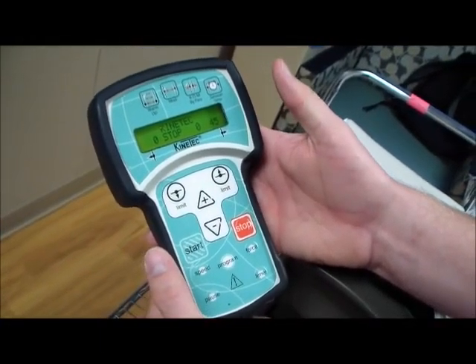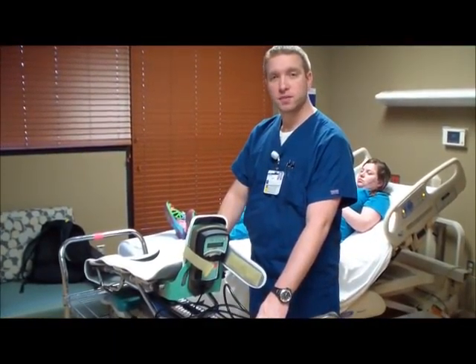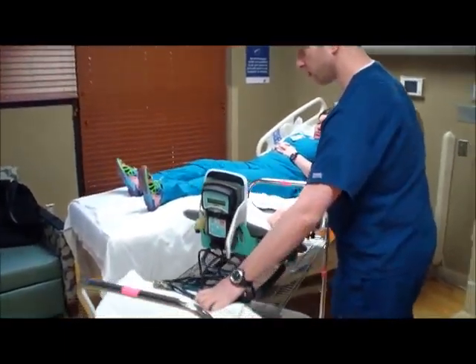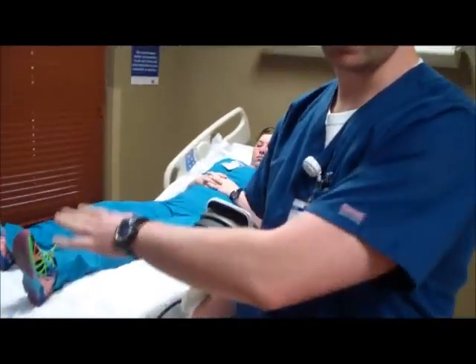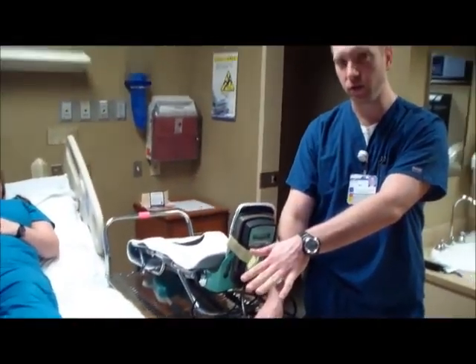So everything's all set for this, so we're ready to place the CPM on. Alright, so when applying the CPM, what you want to do is make sure you bring yourself in close enough where you're able to transfer the CPM onto the patient's bed. This bed, as you can see, is not set up for a CPM to be applied. There's no footboard.